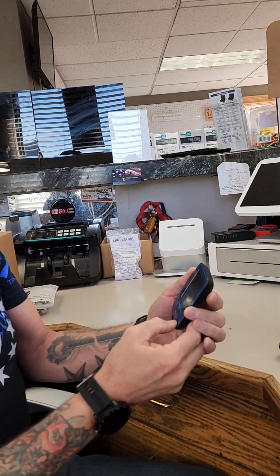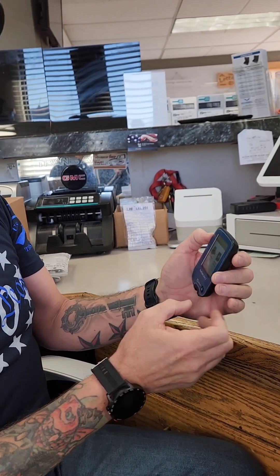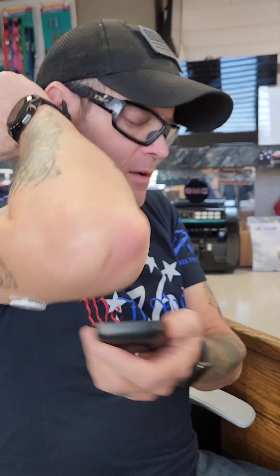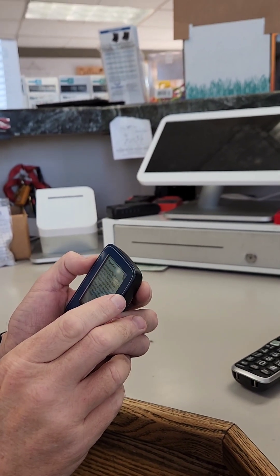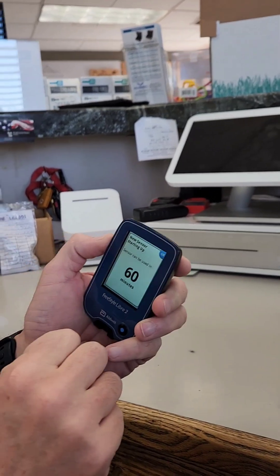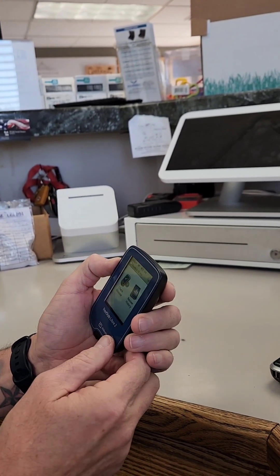Now that I've stuck this on, I have to push 'Start New Sensor' on the device and then scan the sensor. It's telling me not to take high doses of vitamin C — more than 500 milligrams per day — as this may falsely raise your sensor readings. After confirming, it says in 60 minutes the sensor is going to be fully calibrated, so I have an hour before I can start reading with this.